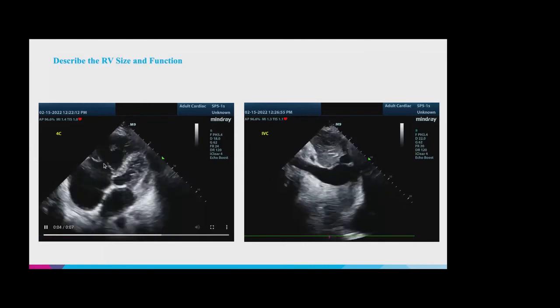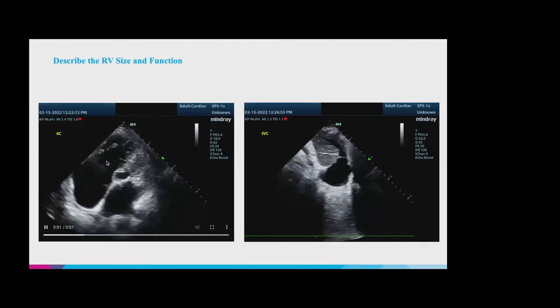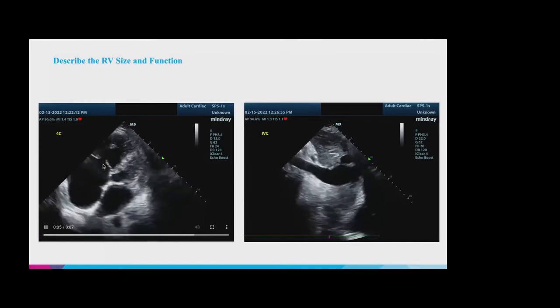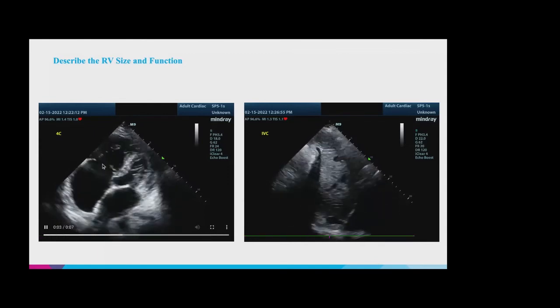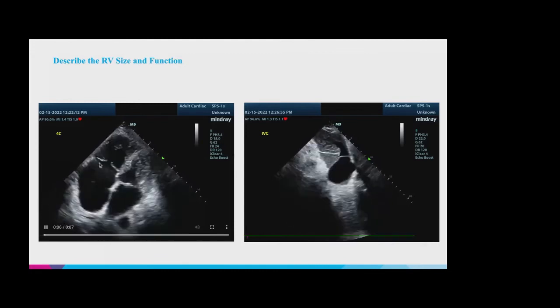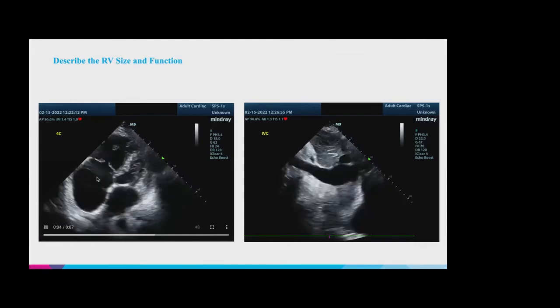Especially in someone who has such an enlarged right ventricle and right atrium. The leaflets are not able to fully close up against one another, right? So even though we don't have color on this image, I can tell you guys definitively that this patient has tricuspid regurgitation, and it's probably severe because there's a hole that separates the ventricle from the atrium. Yep, absolutely.